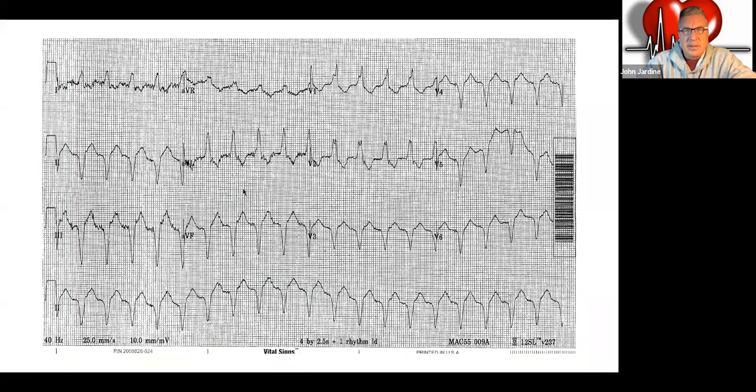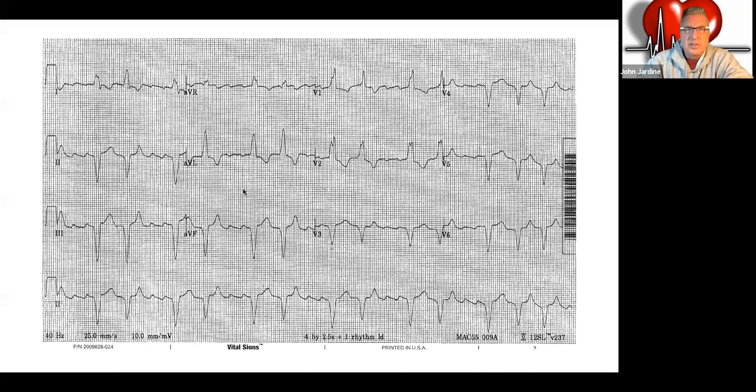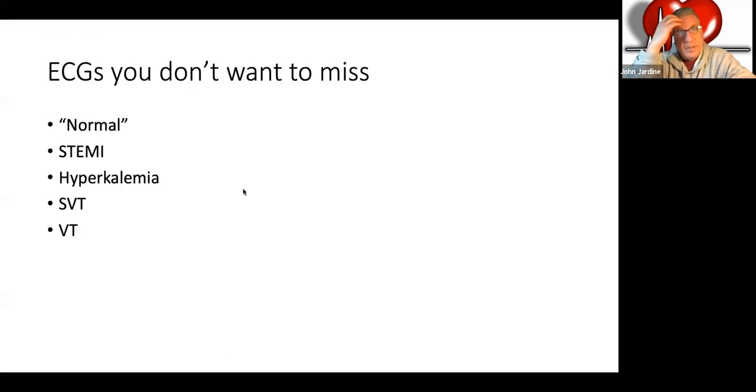So again, I believe this is his actual EKG. This is the 85-year-old guy with the weepy legs. This was his EKG, and you can see that it's VTAC, and it's not quite as fast as SVT. SVT can get up in the 200, 220, 250 range. VTAC is usually a bit slower than that. And this guy, when we slowed him down, you can see that he had an underlying AFib or something going on. So again, this is wide complex tachycardia or VTAC, and you don't want to miss it.